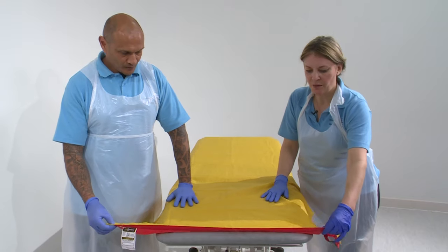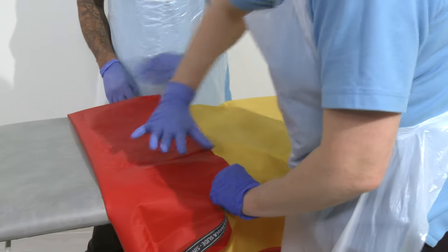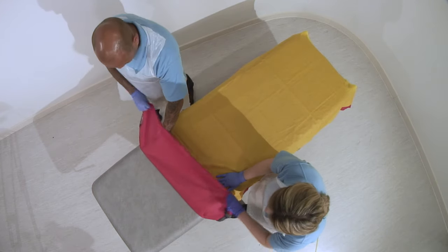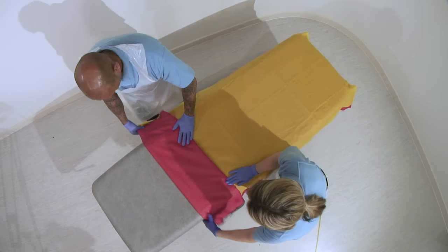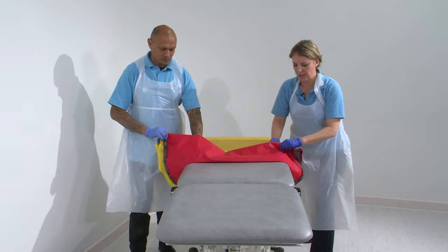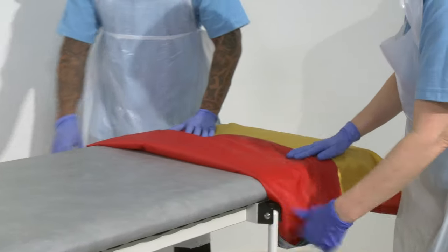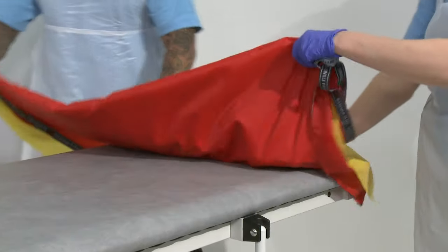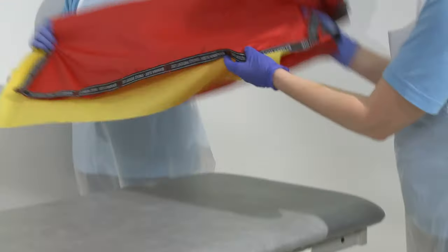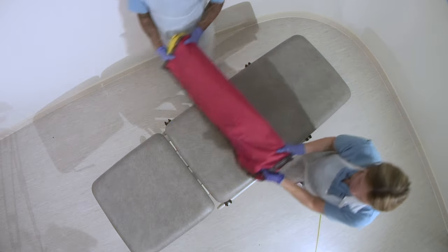So to fold the slide sheets up to get them underneath the patient, you just want to fold them in about a hand's width apart and you just continue all the way down. So when you've got to the end of the slide sheet, all you do is continually fold that over on itself. Nice even folds. Keep going down, keep going down. Take it round and then what you will have is a small flap on the top, and that goes in and underneath the patient's shoulders.